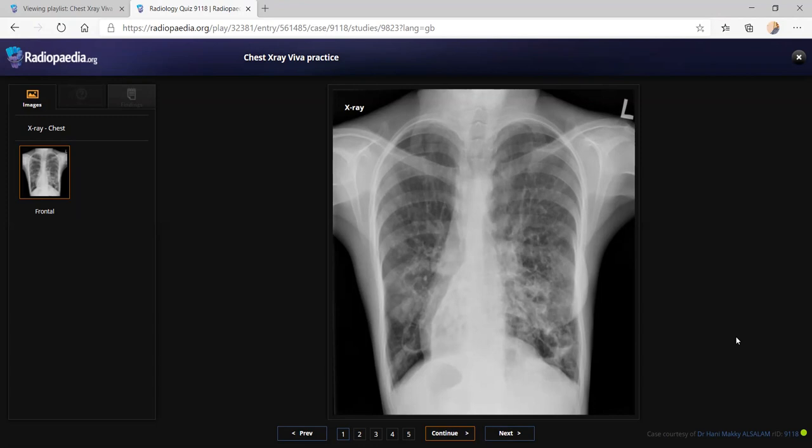otherwise I don't find any evidence of focal lung collapse or consolidation on either side, and the lungs appear a bit hyperinflated, so no obvious pleural effusion, no hilar mass on either side, trachea appears central, and no evidence of pneumothorax or pneumomediastinum, and the visualized bones appear normal.